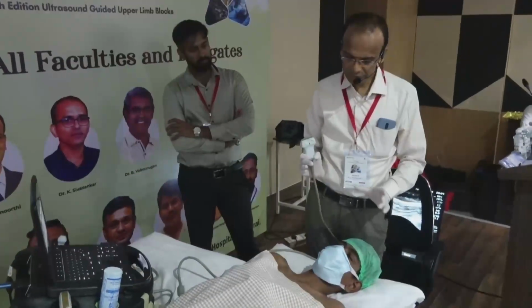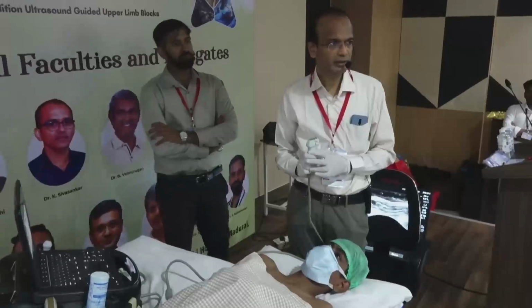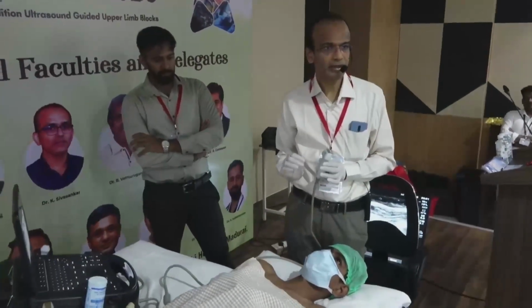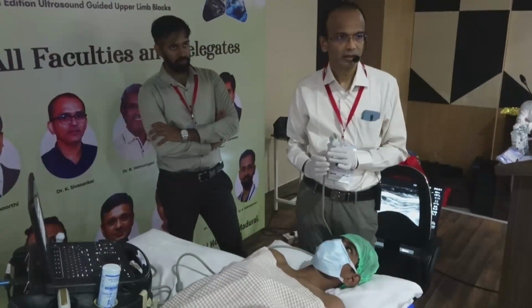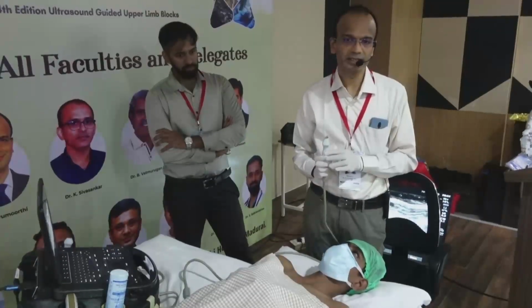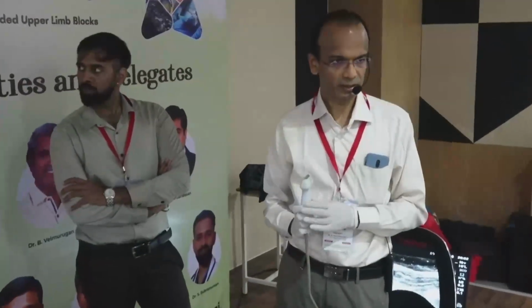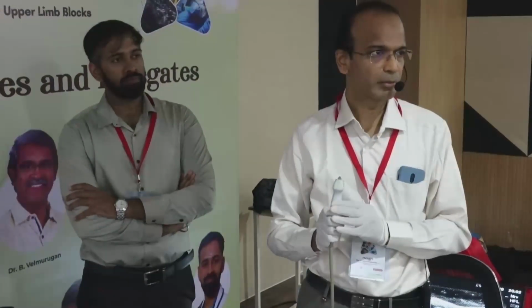So usually we choose supine position, but in the in-plane technique, sometimes we have to choose lateral position, even for supraclavicular block and interscalene block. The other preferred position is head-up position, probably 30 degrees up, especially for interscalene scanning and in-plane technique, it is very useful. Sometimes it depends on the patient's discomfort also, because if a fracture is there, whatever position is comfortable we have to keep.